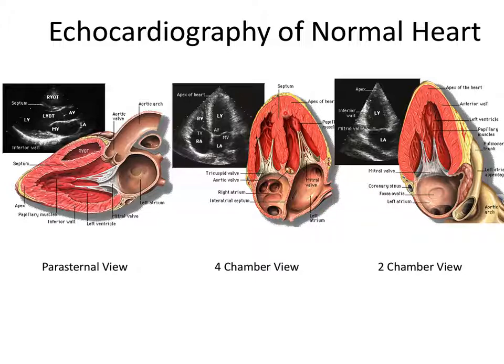And then if we rotate 90 degrees and look right down this line here, we will get the two-chamber view of the heart. And so now we're sampling two different walls of the left ventricle, so this is different muscle we're watching move. Here's the anterior wall, apex, and we get a different view of the mitral valve, right? And you still see the left atrium.